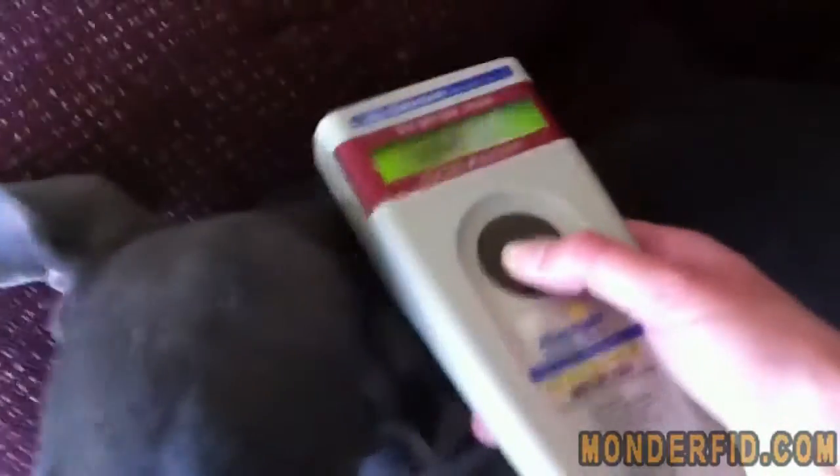And we have another test subject. So we hold down the button, it starts scanning. Get it close to Misty. Oh, and there is Misty's AVID number. So, pretty easy.